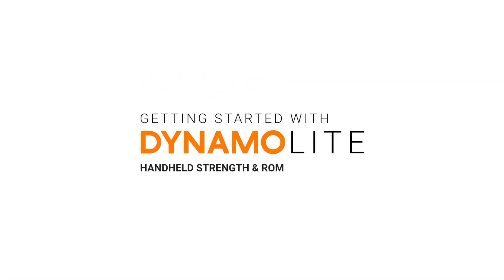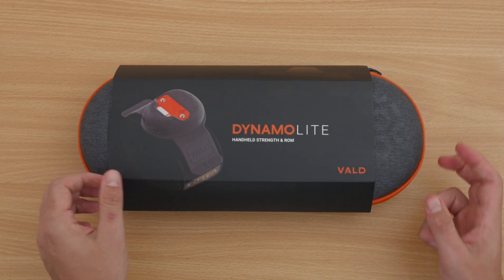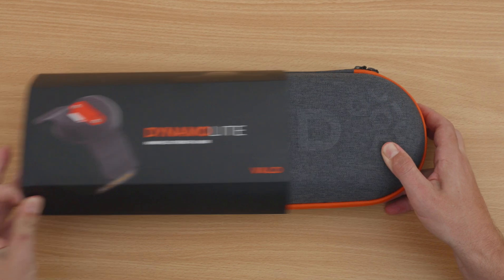Welcome to getting started with the Dynamo Lite — your handheld compression and range of motion testing system, ergonomically designed to fit in the palm of your hand.